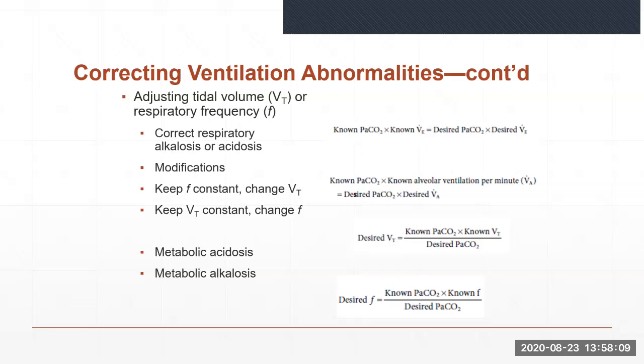Patients in apparent respiratory distress may present with metabolic acidosis. These patients often are struggling to lower the PaCO2 to achieve some degree of hyperventilation to compensate for the metabolic acidosis. As a consequence, these patients are at risk for developing respiratory muscle fatigue. In this situation, mechanical ventilation is indicated to meet the minimum goal of compensated hypocapnia.